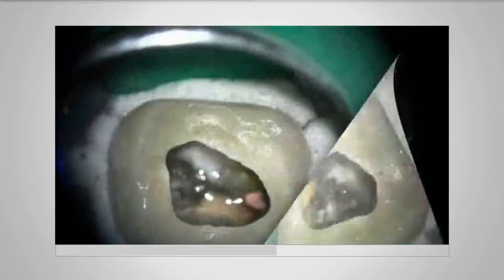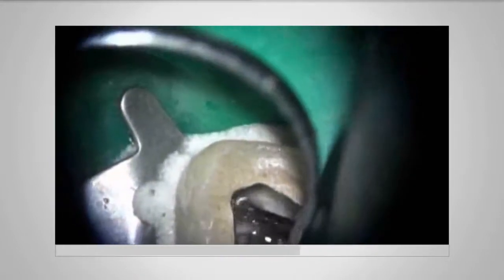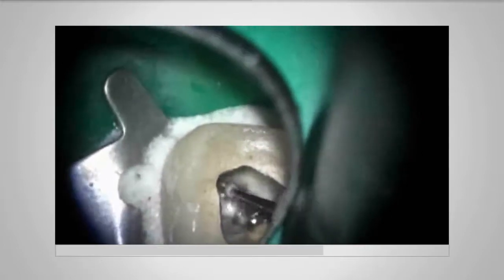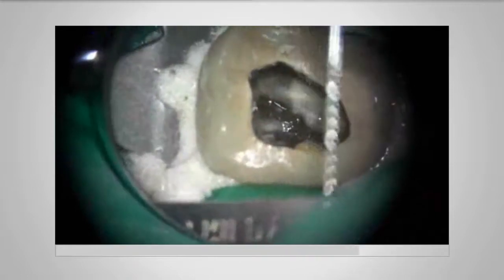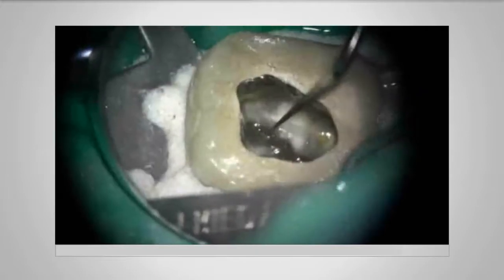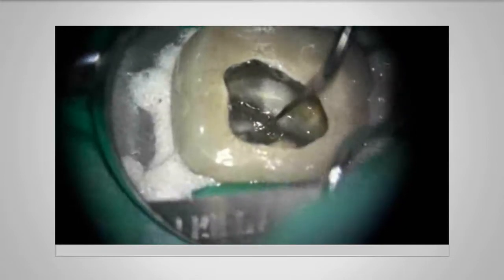With an LN burr, I'm going to chase out the trough between the MB1 and the MB2. I will be covering this later in the presentation, location of MB2. This just takes away some of the calcification that's at the orifice. And then with a micro opener, I can start to try and tease open the orifices of the root canals. There we are, that's the MB1, MB2, and obviously the palatal, which has got the existing root filling in there.